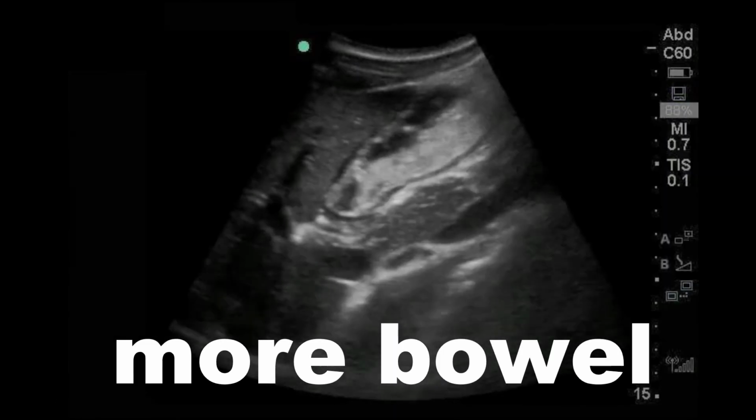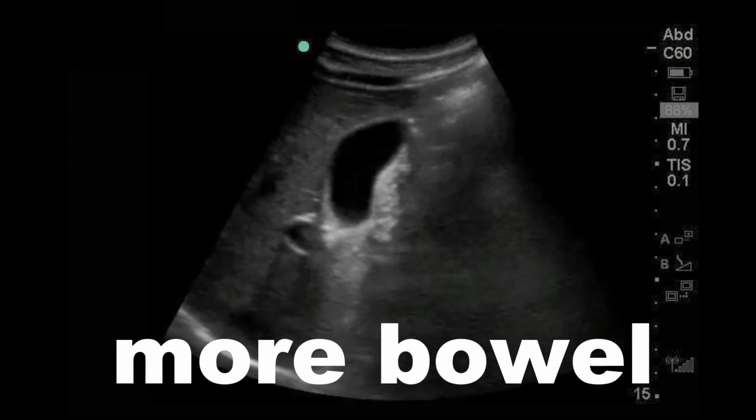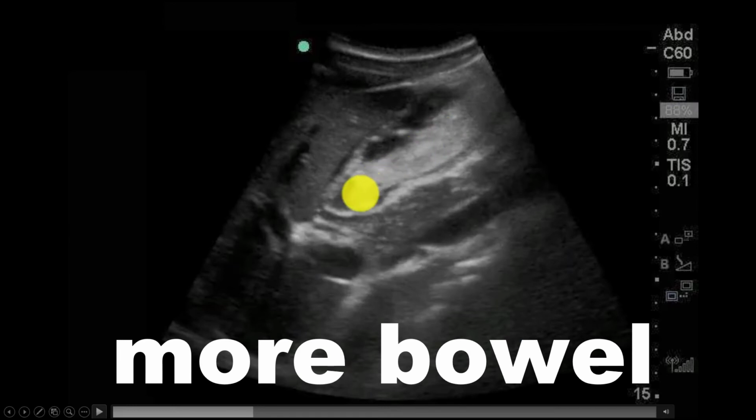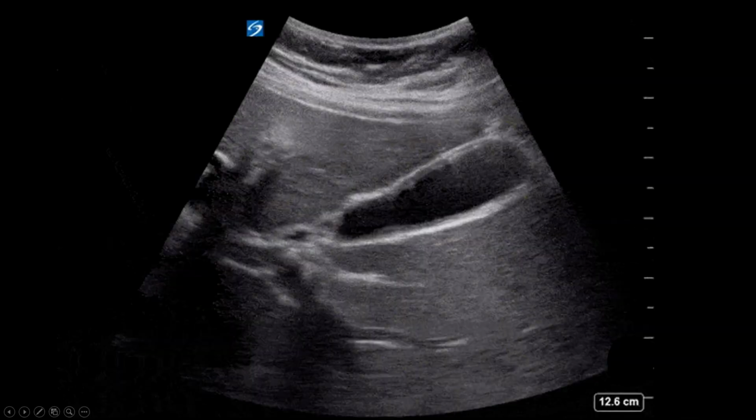Here's another example of a patient with bowel next to their gallbladder. Do you see the difference? You'll see peristalsis happening throughout this loop of bowel. So just another thing to keep in mind.